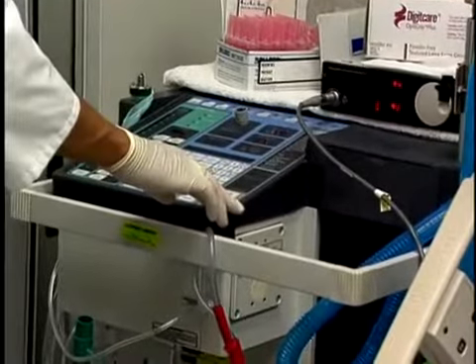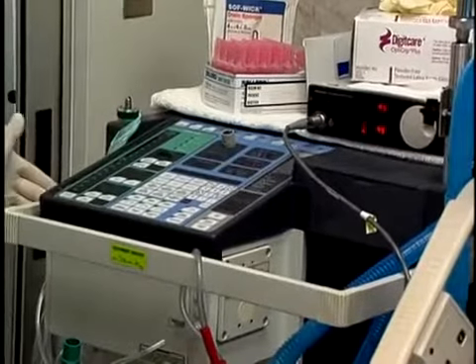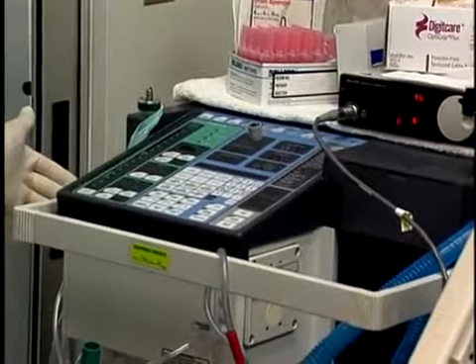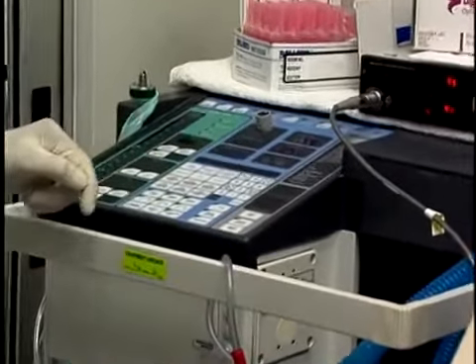Pressure alarms must be set as sensitively as possible to ensure an alarm trigger for disconnect, as well as a trigger for high pressure, which may indicate airway obstruction. The patient's airway pressures should remain within their normal allowable limits during valve use.